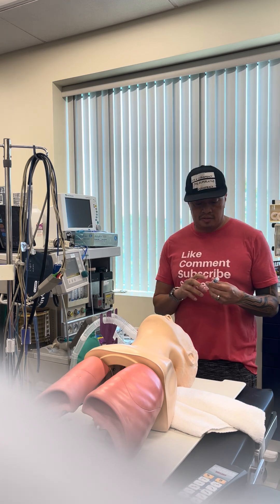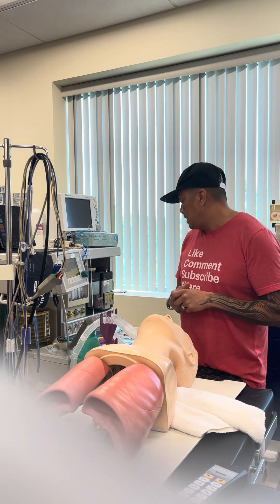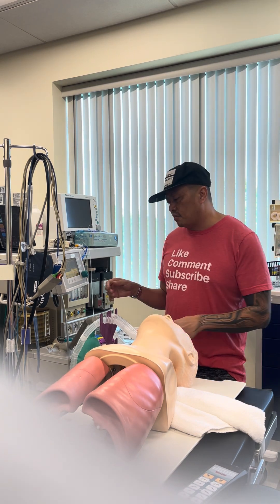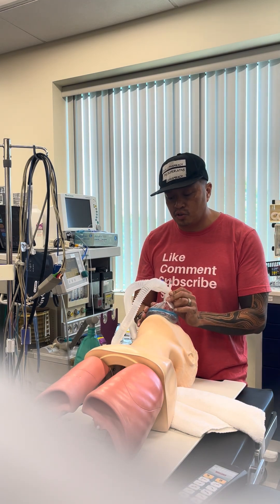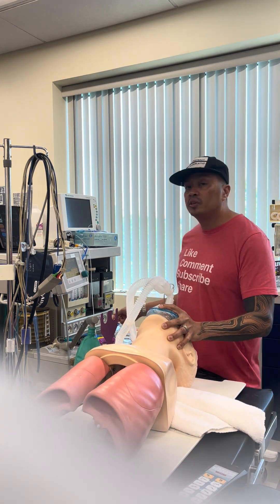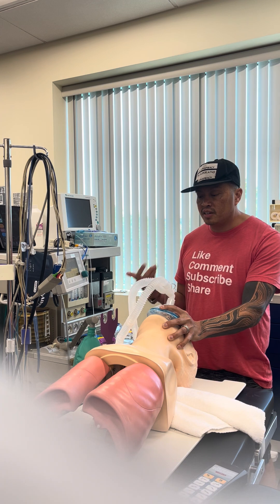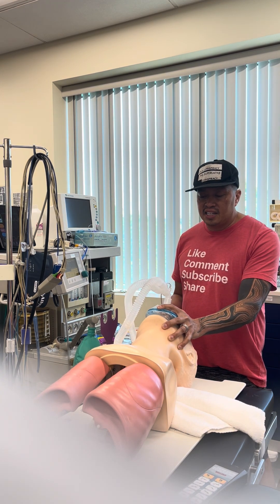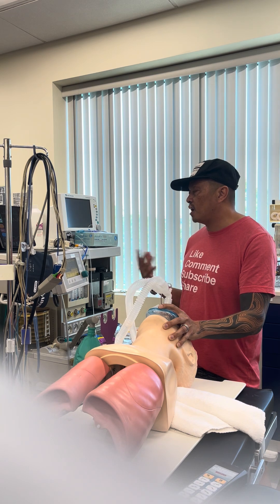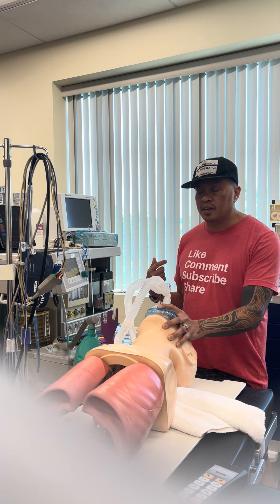As he's scooting over, I'm going to give him 2 milligrams of Versed. 'This medication is going to make you more comfortable, Mr. Smith, and it's going to make the intubation procedure go much more smoothly.' I'm going to put the mask on lightly on top of your face, cover your nose and your mouth, bring your chin up for a nice seal, and then I'm going to pre-oxygenate Mr. Smith — bringing it up to 5 liters per minute. 'Take a couple of deep breaths, best oxygen in town. Just relax and let the Versed start to kick in.' I'm checking to make sure that his ETCO2 waveforms are coming up, that they're appropriate, his ETO2 is over 80%, and that he's tolerating the mask well.